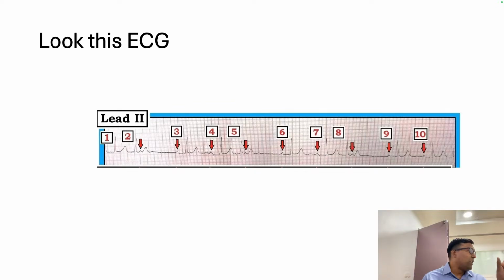When we say complete heart block, it means P activity is more than QRS and it has not been conducted. Bradycardia can be due to a lot of reasons, but when there is AV dissociation, with more P waves than QRS, we call it third degree block. If there is some association, it can be type 2, and if all the conduction is going on, that is type 1. Type 1 means a first degree AV block. So what exactly is it? Any interpretation?